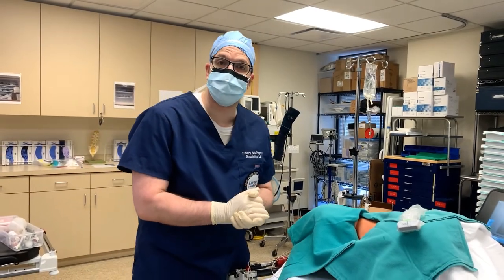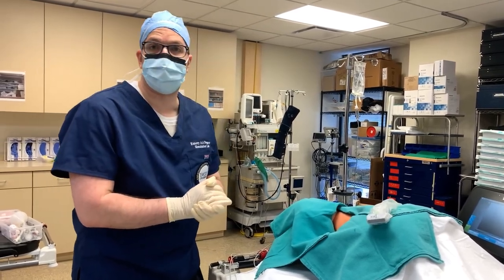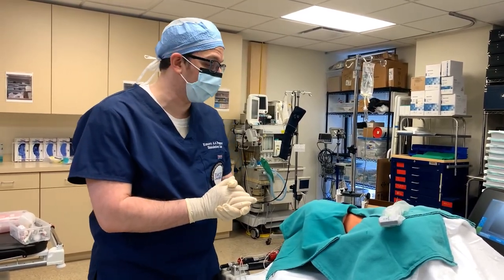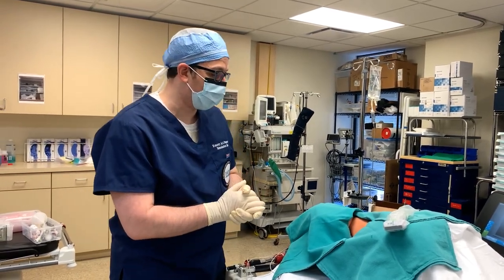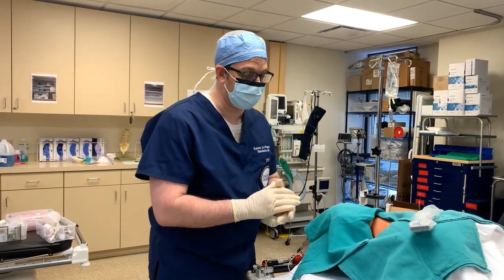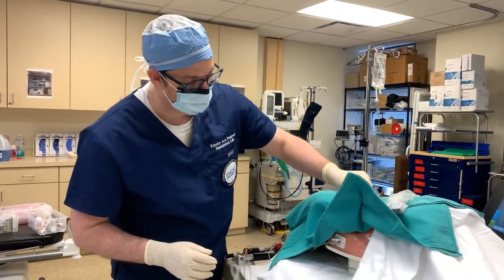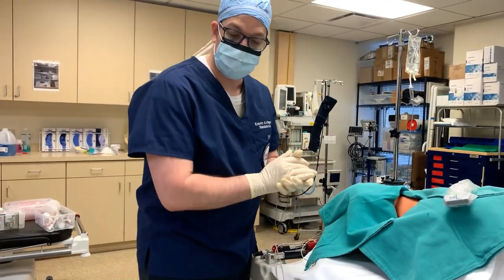This is patient John Smith, medical record number 12345678, date of birth January 27th, 1967. He is here today for a right-sided interscalene block. His consent is signed and the right side is marked. So we're going to go ahead and get started.